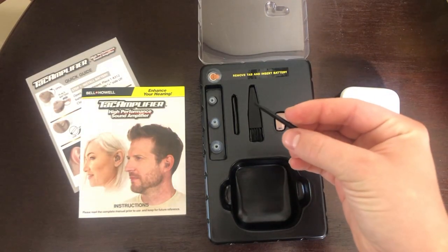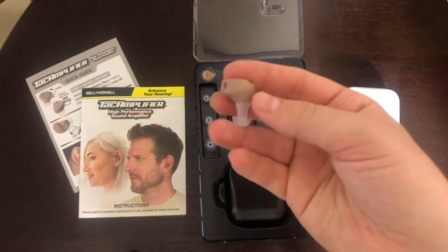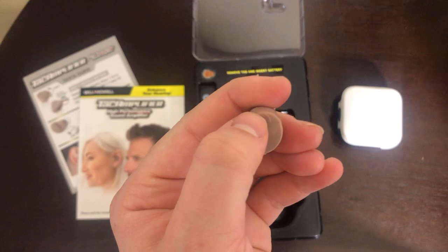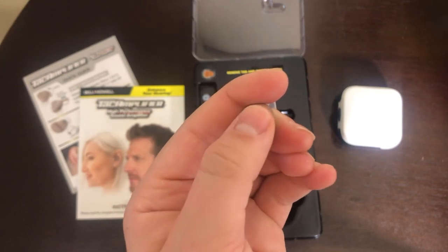Next we have a variety of cleaning tools for the earpiece, and then the earpiece itself. It's fairly small, and I can already tell that the default earpiece will be too big for my ear — I have very small ears. The volume knob turns pretty easily.